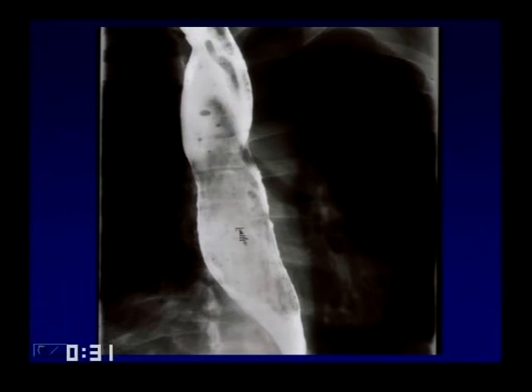Here we have a large intraluminal filling defect in the esophagus — it's very long and very smooth. Asking about the clinical context, it doesn't look geometric like a foreign body. This is actually a fibrovascular polyp. Fibrovascular polyps can become very long with a very narrow pedicle not visible on the upper GI, so you can't see the attachment to the wall. You simply recognize it as a cause of a very long smooth filling defect; the differential includes lipoma.